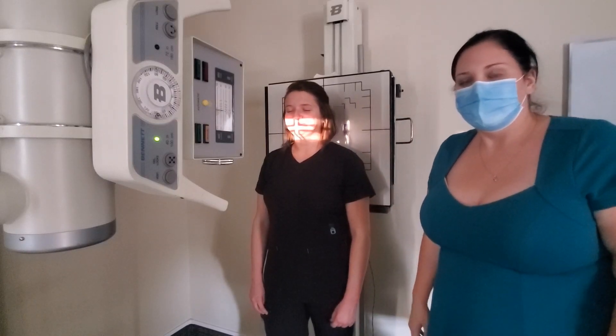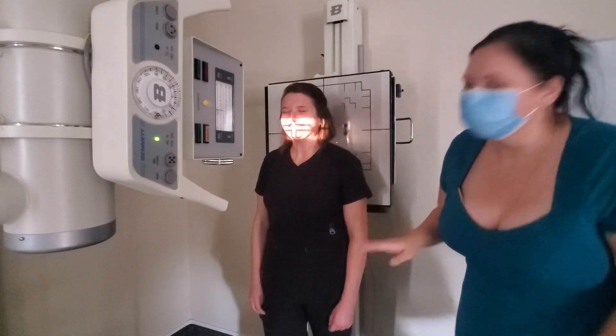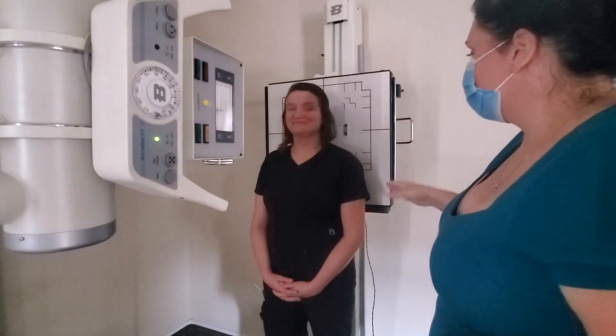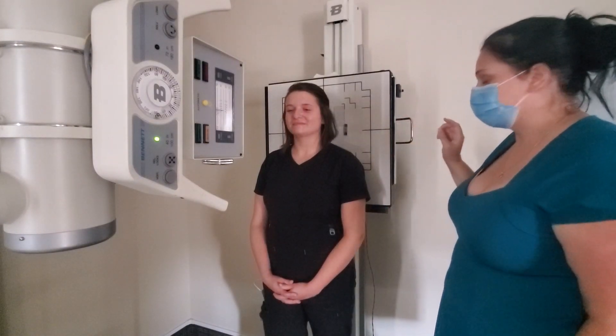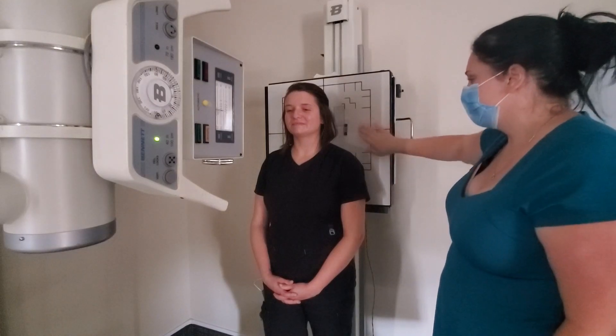For this image you could tell your patient to phonate 'ah' if necessary. Then go ahead and have them close their mouth so they can relax. That completes your dens projections.